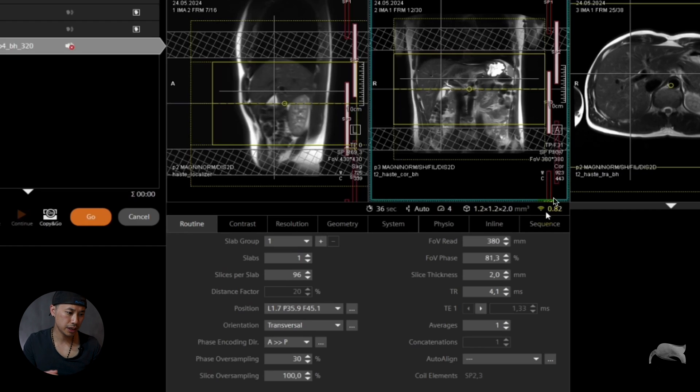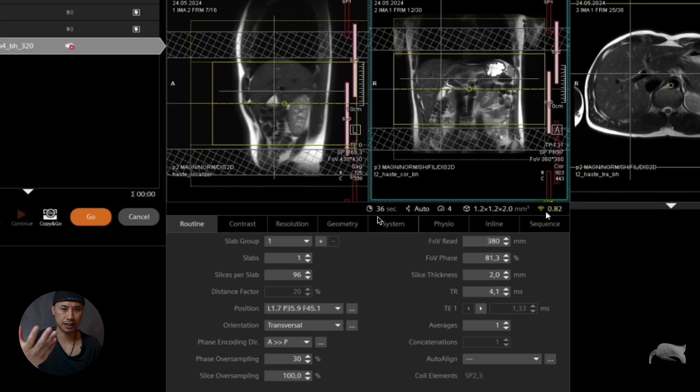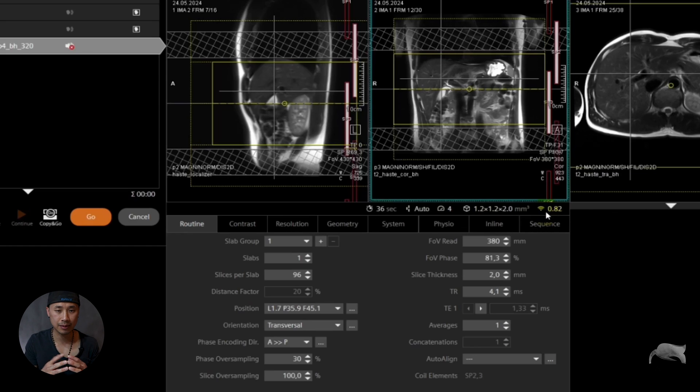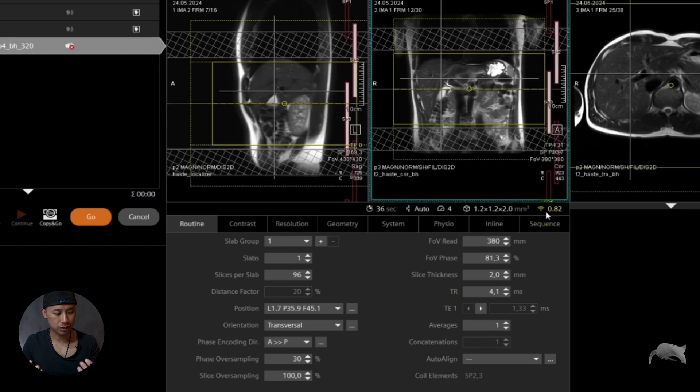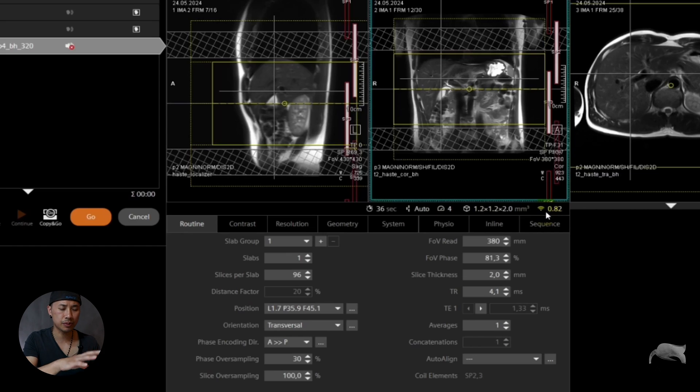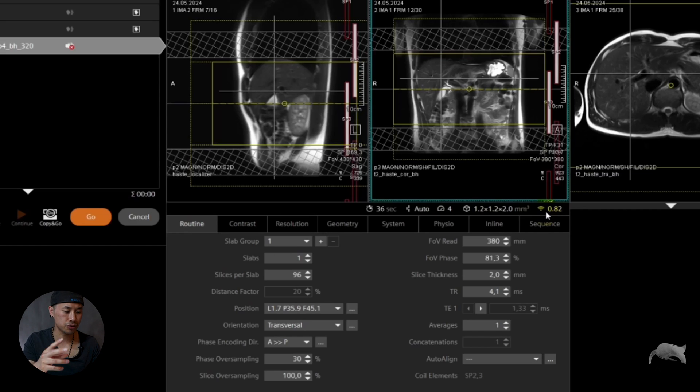Now I have 96 slices to cover the top and the bottom of the liver. You get a little bit more signal but the scan time is still very high. However, there are techniques to push the scan time lower like GRAPPA, iPAT imaging, high acceleration and so on, but this is the very basic I'm about to show you here: what happens if you control the slice resolution and the voxels.